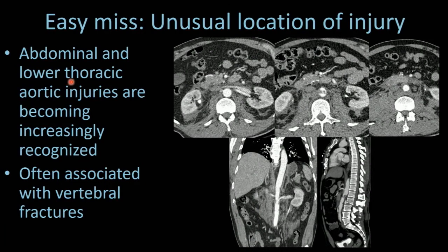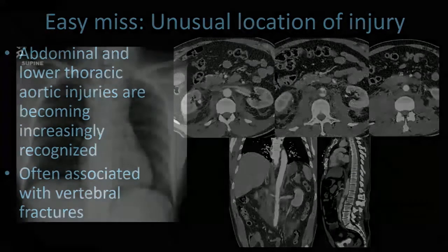Abdominal and lower thoracic injuries are becoming increasingly recognized. Another patient with an abdominal aortic injury has a thrombus and blood around the aorta. They're often associated with vertebral body fracture. So if you see a vertebral fracture, particularly a compression type injury, take a very close look at your abdominal aorta.